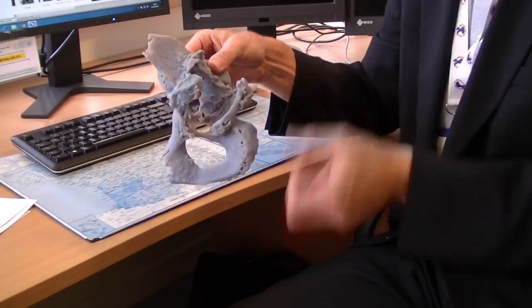So I can first of all tell, yes, I can complete the surgery and do a good job for you. And secondly, I've got a good idea of the order I would put sizes in to allow me to finish the surgery safely. So I've got an example of a 61-year-old who I operated on using the model to plan my surgery. He'd previously been involved in a road traffic accident in his 20s. He'd had a pelvic fracture, he had a thigh bone fracture, a shin fracture, so multiple injuries. And he subsequently had a hip replacement at a very young age, in his 40s.